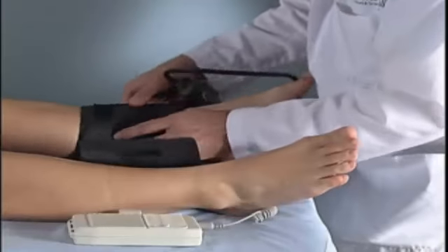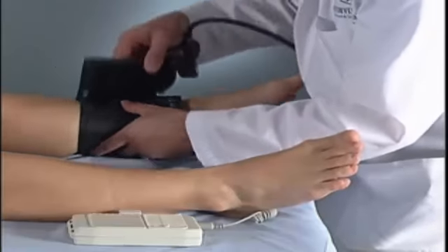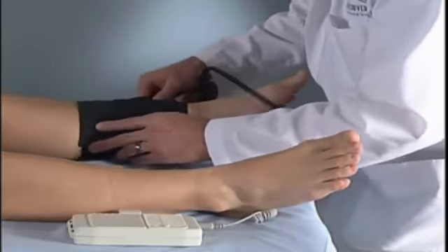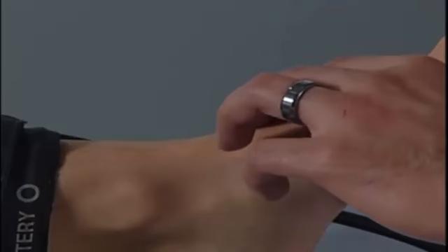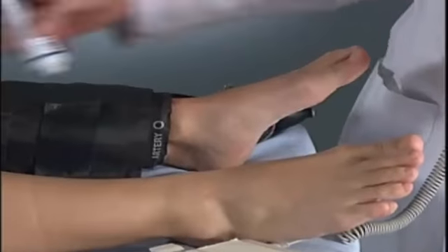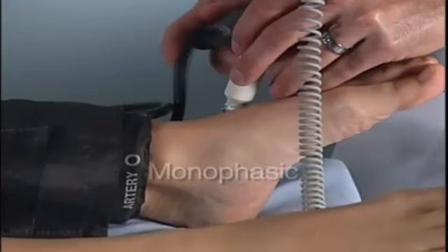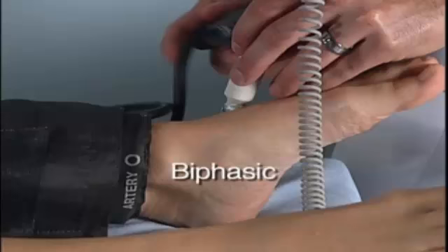Following measurement of the systolic blood pressure in the upper extremities, measure the systolic blood pressure in the lower extremities. First, place the cuff above the ankle. The dorsalis pedis artery is located initially by palpation or identified by Doppler alone if no pulse is felt. You should obtain an arterial Doppler signal, which can be monophasic, biphasic, or triphasic.